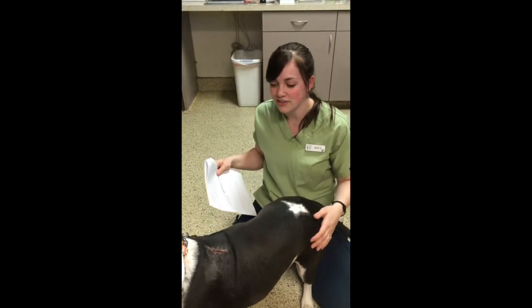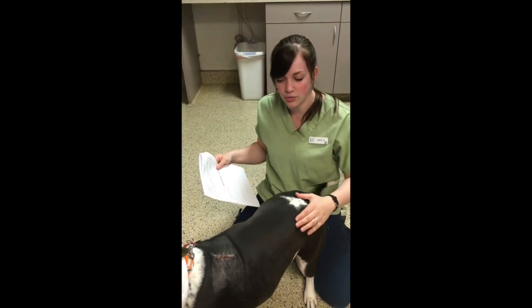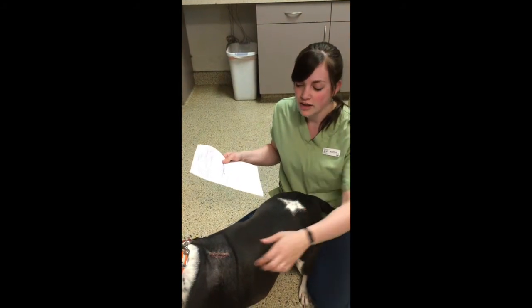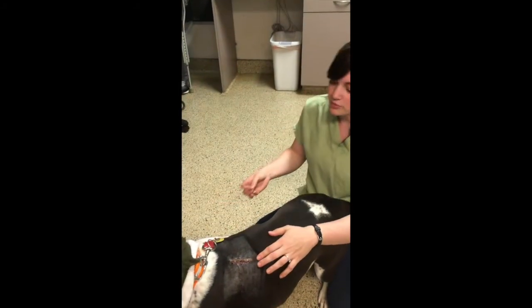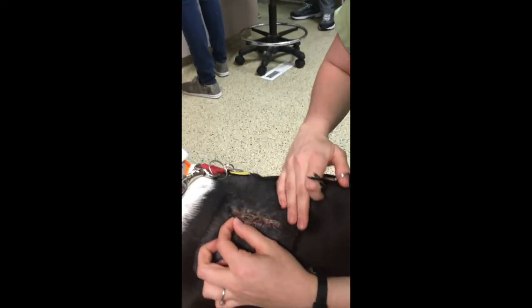Alright, so this is Daisy. She had a mass removal on May 10th, and today is the 22nd, so it's been 12 days. That's an appropriate amount of time to remove sutures. The mass removal is here, so I'm going to go ahead and remove the sutures. I have my suture scissors. Making sure the incision looks well, it's healed well.